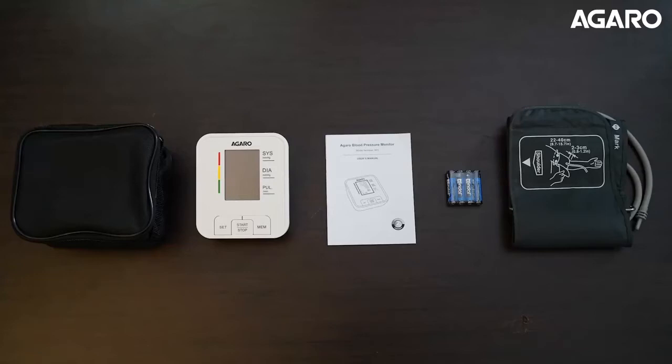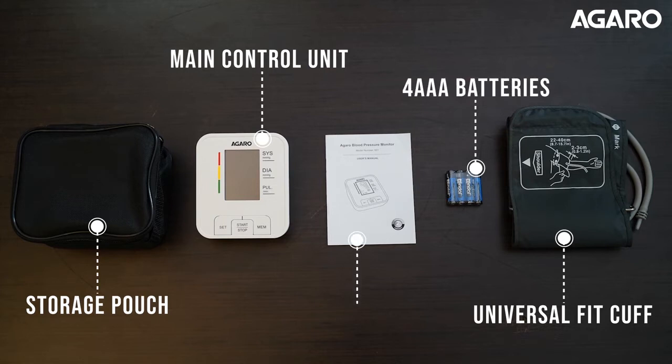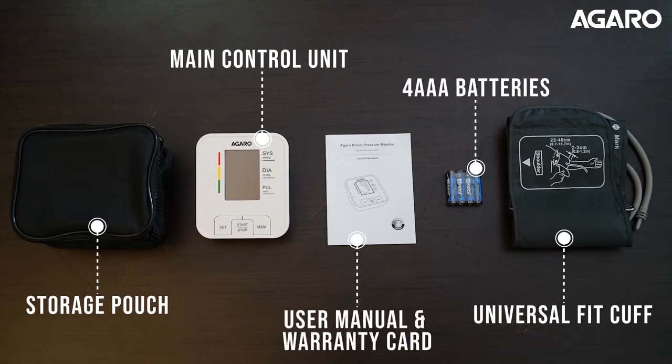The Agaro BP601 Blood Pressure Monitor comes with one main control unit, one universal fit cuff, one storage pouch, four AAA batteries, one user manual, and one warranty card.